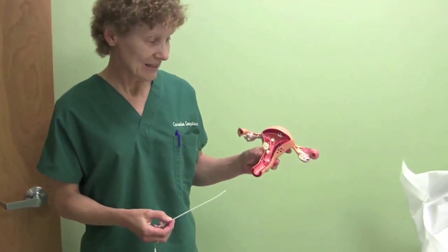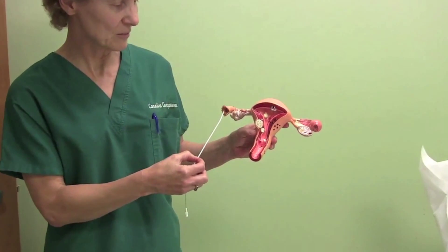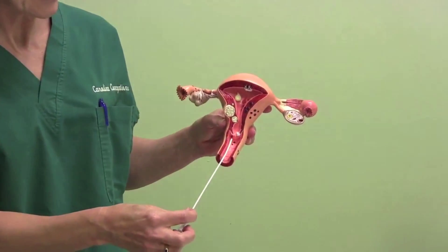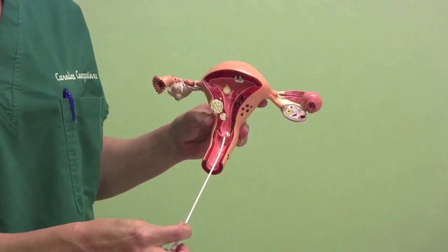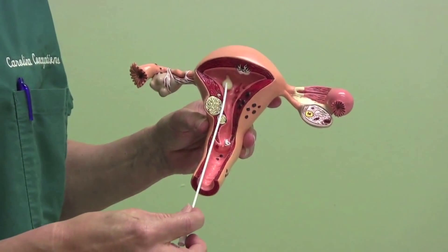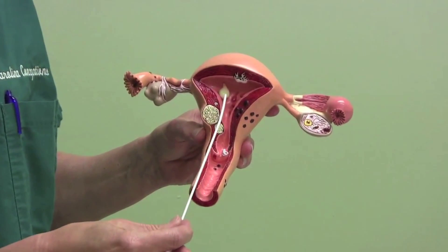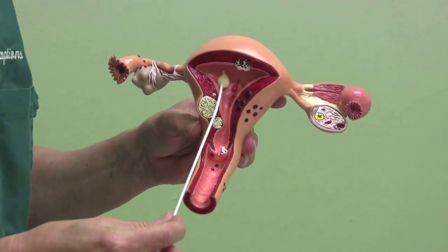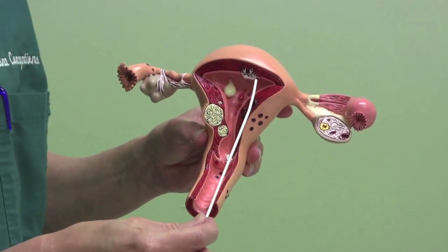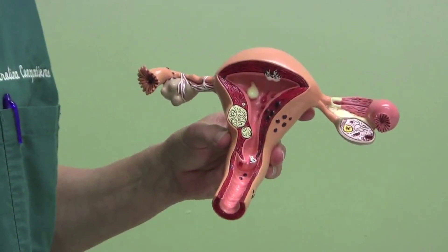This is a little model looking at a uterine cavity and fallopian tubes. Basically what happens with the HSG is there's a small catheter that's passed through the vagina and cervix, and the dye is instilled into the upper part of the uterus. It will show us if there are any filling defects such as a polyp or fibroid, and then we'll see the dye hopefully go out the tubes into the abdominal cavity.